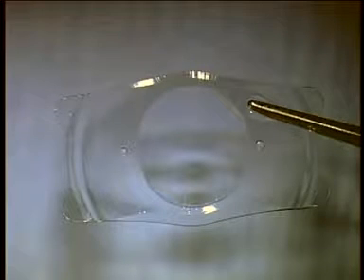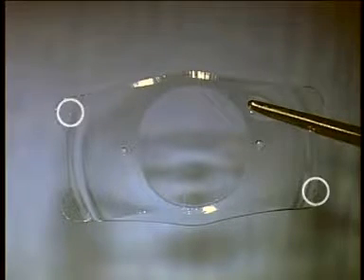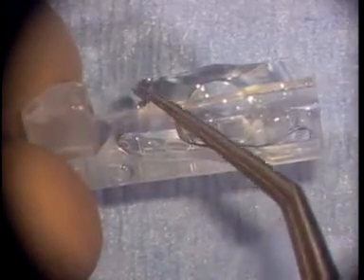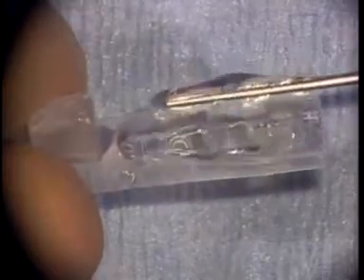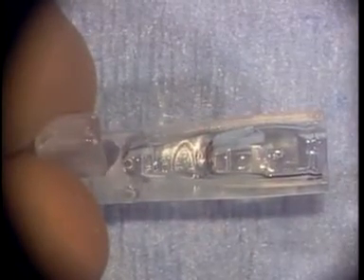Using a forceps, gently lift the ICL from the vial by carefully grasping the lens haptic. Inspect the ICL under the operating microscope to identify and verify the correct orientation of the lens. The footplate marks on the leading right and trailing left haptic indicate that the correct convex side of the ICL is facing up. With the cartridge in one hand and the forceps holding the ICL in the other, place the ICL into the cartridge bay so that the long axis of the lens is positioned into the groove under each side rail of the cartridge. Remember that the ICL must be convex in the cartridge with both edges below the side grooves.